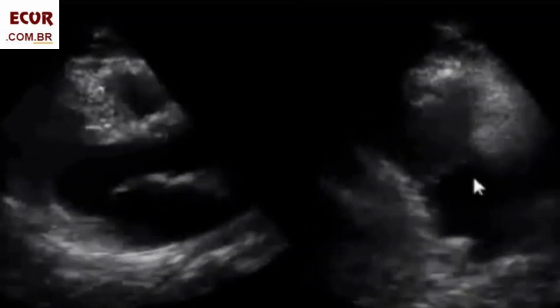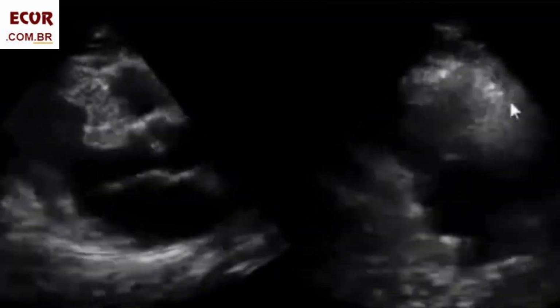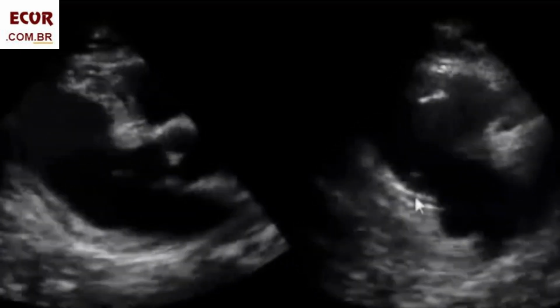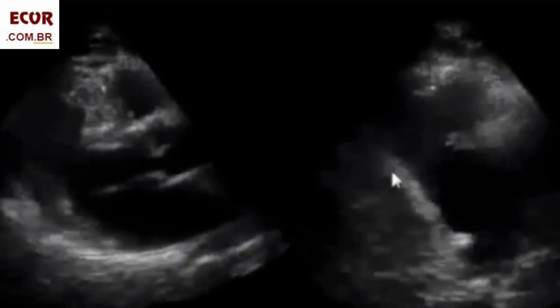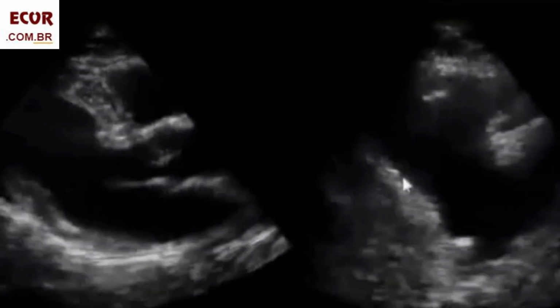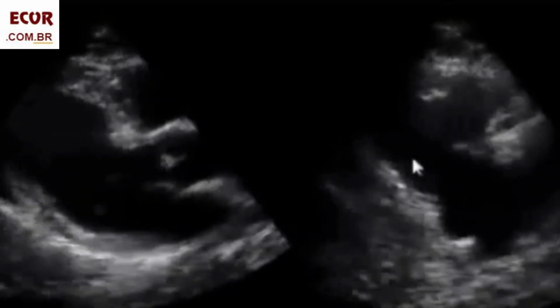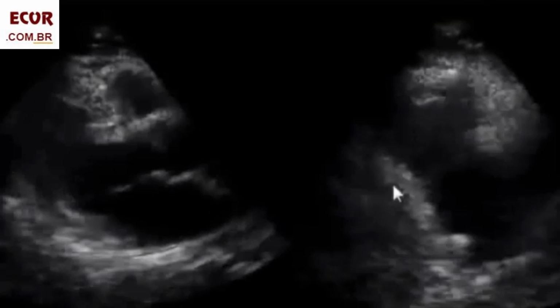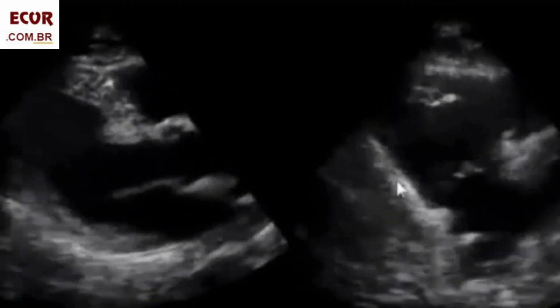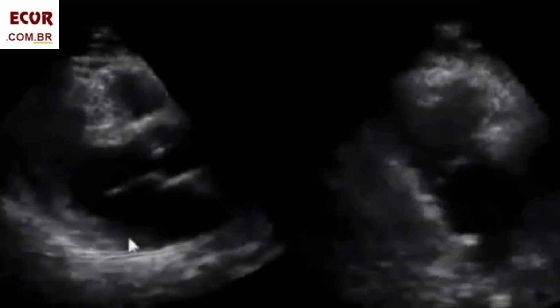In the parasternal long axis of the right cavities, right ventricle inflow, outflow, tricuspid, anterior and posterior leaflet, and right atrium. Notice the inferior wall of the right ventricle does not thicken. It's fibrotic. What we see as movement of this wall is just pulling by the other normally contracting walls. This is an obvious infarct of the inferior wall of the right ventricle. It may be even more extensive than the one we're seeing here in the inferior wall of the left ventricle.